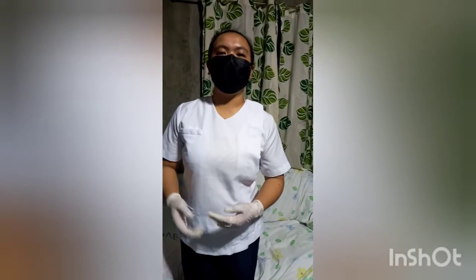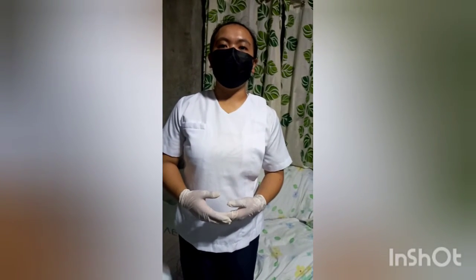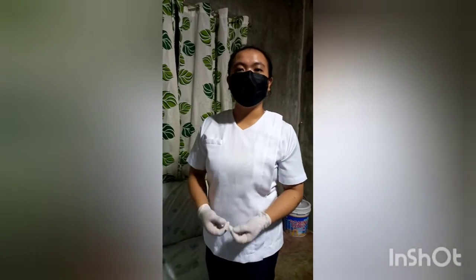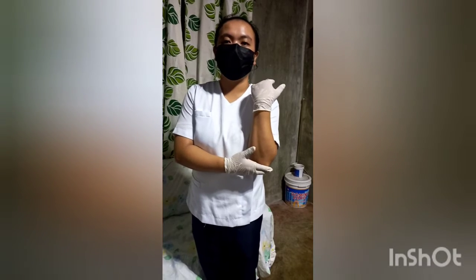So, the next procedure is to place the ECG machine close to the patient's bed and plug the power cord into the wall outlet. If the bed is adjustable, raise the bed to a comfortable working height, usually elbow height of the caregiver.